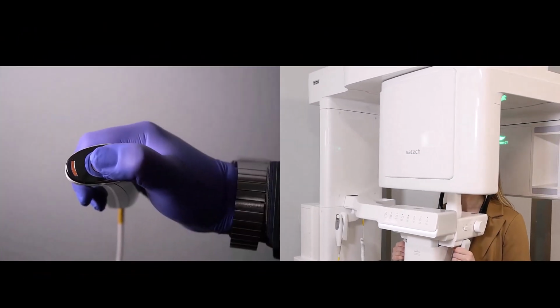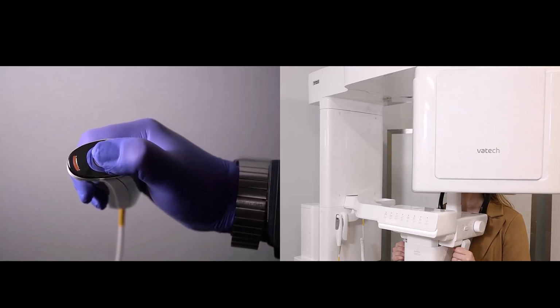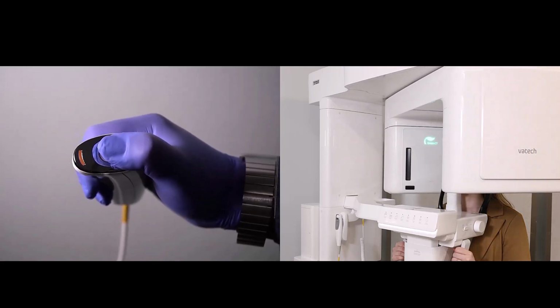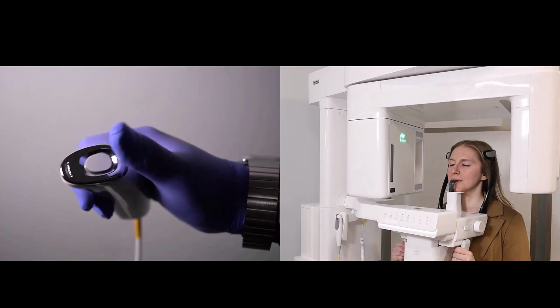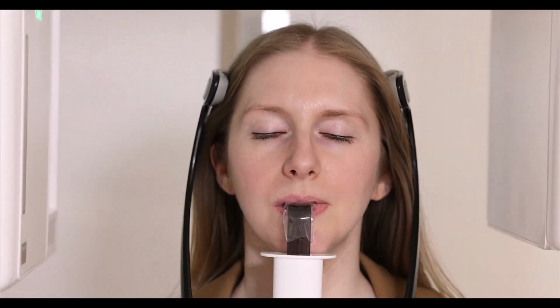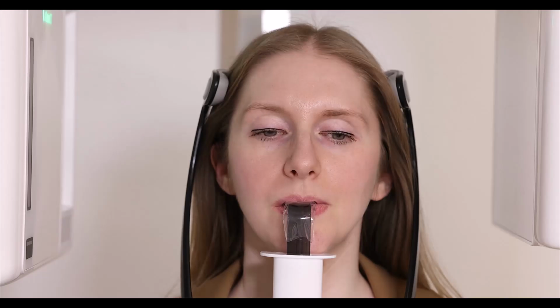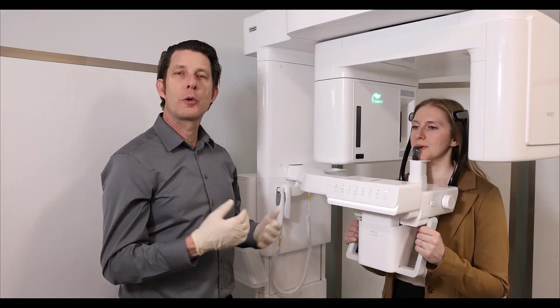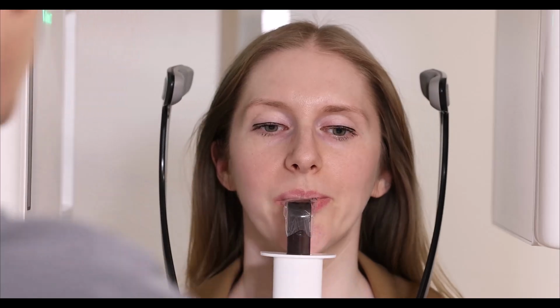Please close. Hold the button on the acquisition trigger switch, which will turn yellow when exposing. Hold the button until the image acquisition is fully complete. Image capturing is complete. Please wait a moment. Please open your eyes and follow the operator's instruction. We've completed our 4x4 capture. I'm going to go ahead and release the temple supports and move our patient out of the machine. Go ahead and take a step back.